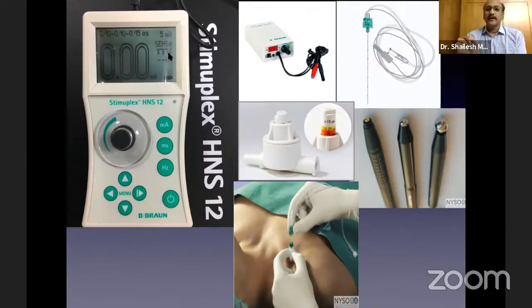Pulse width, so that it is easier. There is less chance of missing the nerve, locating the nerve. I will not go into the details of these basics of the nerve stimulator. This is a separate topic altogether.